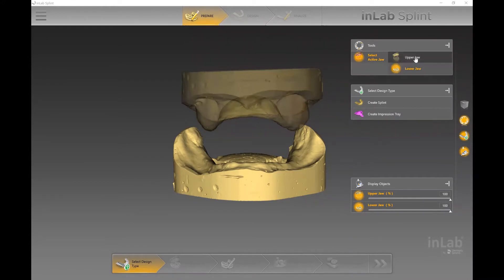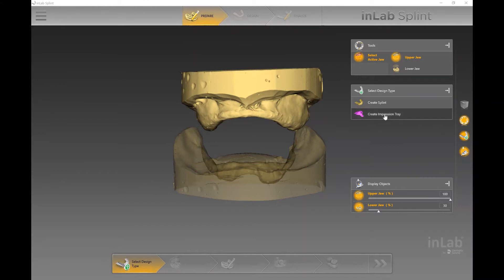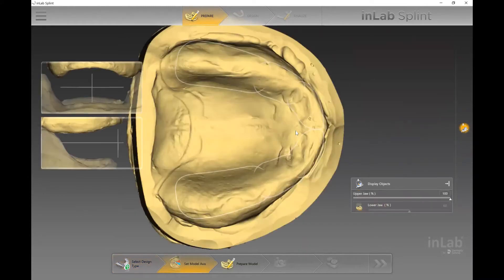Today we're going to take a look at the custom tray workflow in the InLabSplint software. This is where you can design either a Michigan splint or an impression tray. The very first step in the prepare phase is where you need to select the design type, because the software needs to know which one you're designing. I'm going to select 'Create Impression Tray' here.